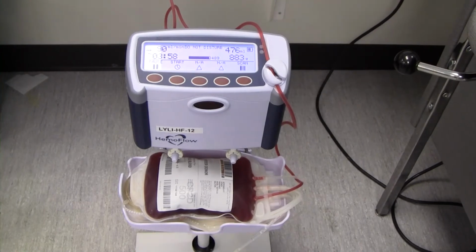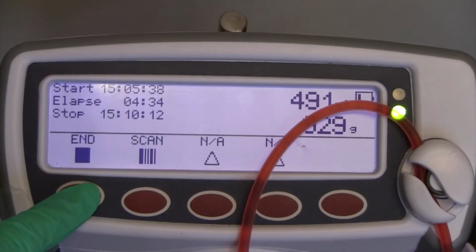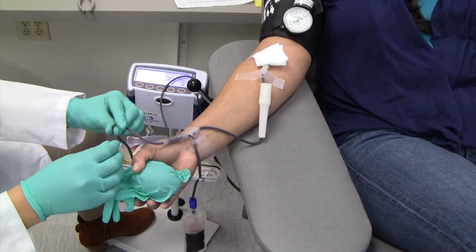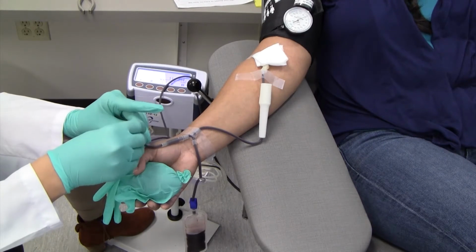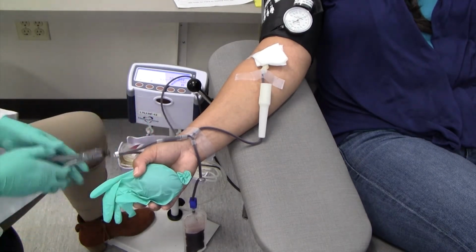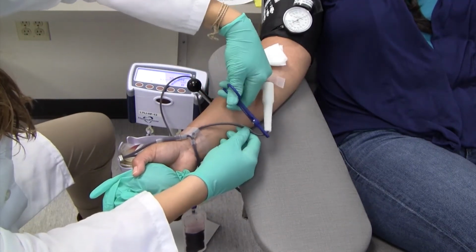Discard unused DINs. Monitor collection for adequate flow. Monitor donor for symptoms of a reaction. Press end once. Seal tubing approximately 3 inches below the Y in the tubing between the snap open closure and collection bag. Clamp a hemostat on the tubing between the Y and PPD as close as possible to the PPD.